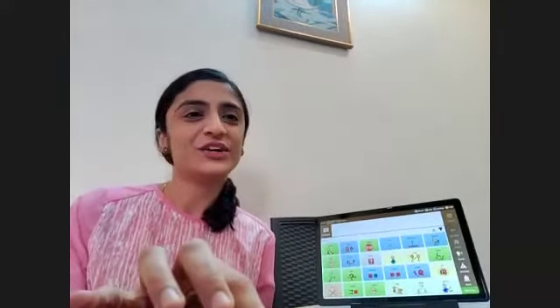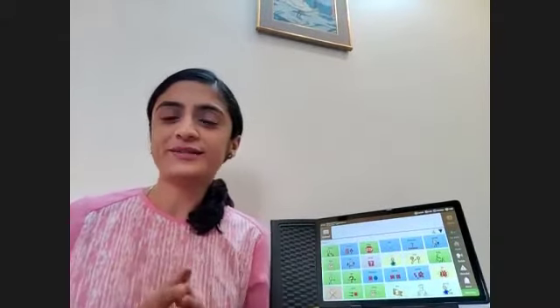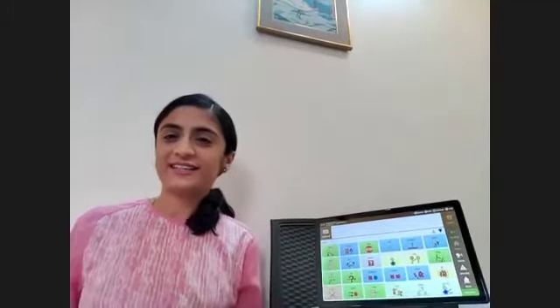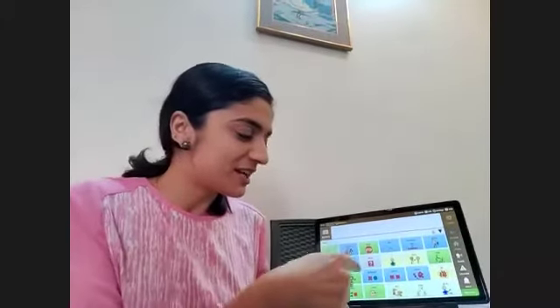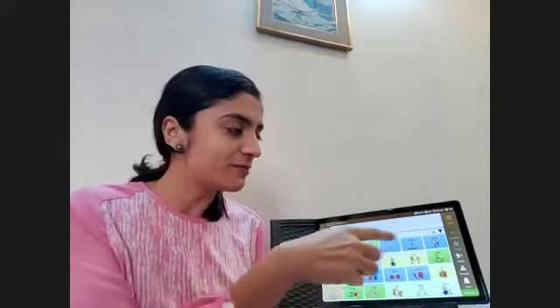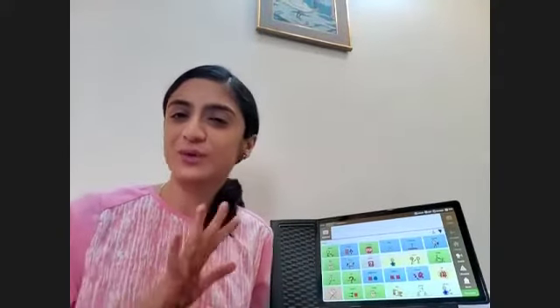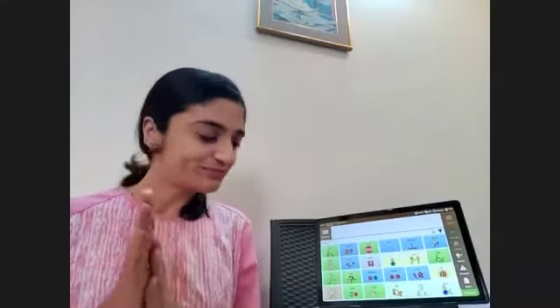Okay, I think that's all of the strategies. What I'll do now is we'll get started with the book. So all of you get your Avaz device ready, and let's get going. You'll see that I've made some changes to my Avaz device. I've made the advanced screen my home screen, and I've added a couple more words to suit it. That's why it looks a bit different. I just thought I'd put that out there before we begin.